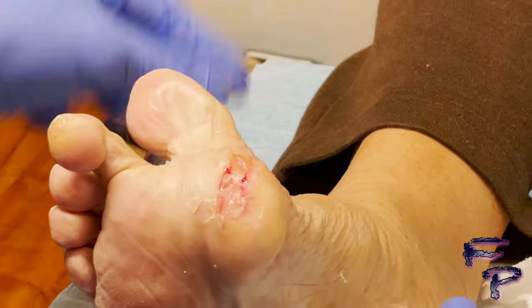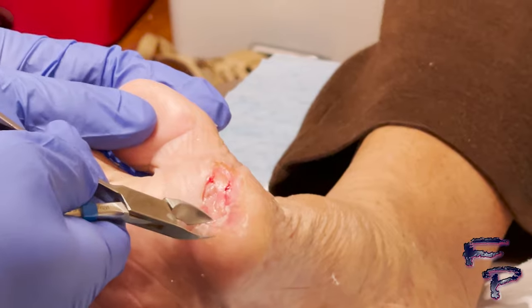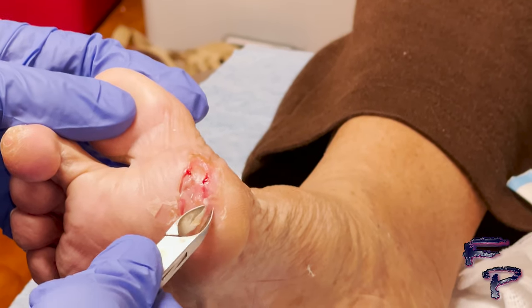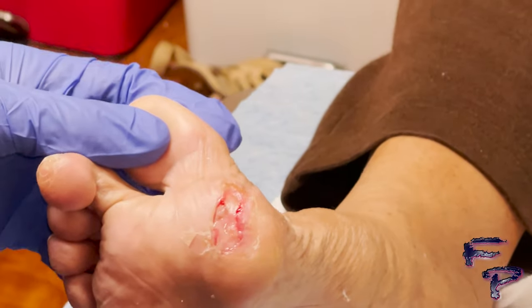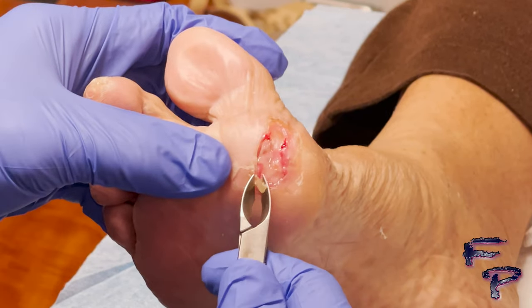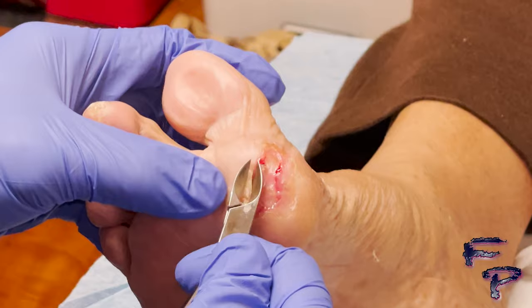Making my way around, I can see additional loose tissue which I am separating. The reason you want to remove this tissue is to not allow bacteria to collect underneath this pocket of loose skin, as skin closing above it will increase bacterial load and eventually result in an abscess.